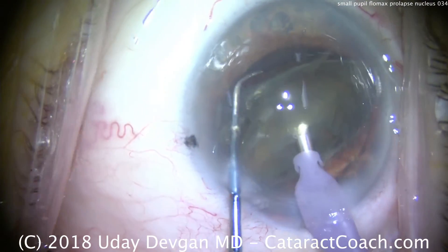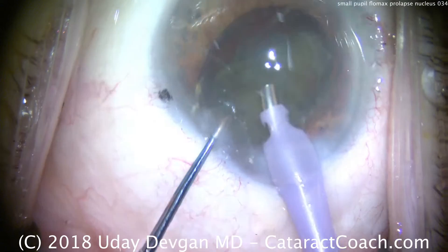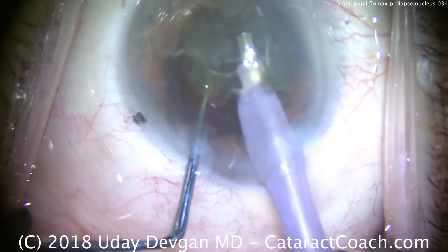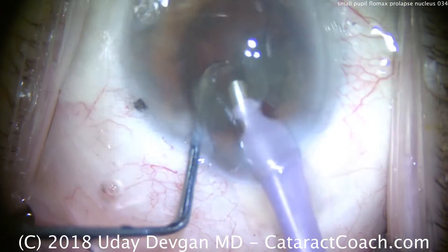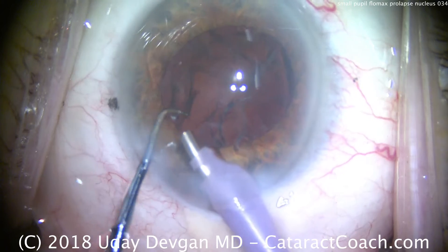There's the second half of the nucleus. We can chop it again, and there are two halves of that — now these are the two quarters. Take out each of these quarters. The chopper is used to push the cataract pieces and keep them in front of the phaco probe at all times. Now the chopper goes into a safety position to ensure the posterior capsule does not come in contact with the probe. That looks pretty good.